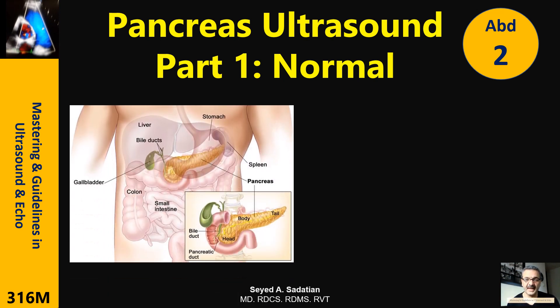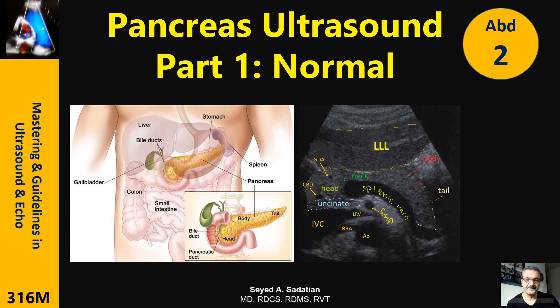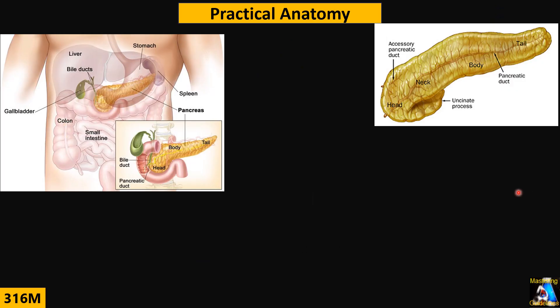Welcome to mastering guidelines in ultrasound and echo. In this presentation I'm going to cover normal ultrasound of the pancreas, and the next lecture will cover abnormal findings. The pancreas is an exocrine and endocrine gland.